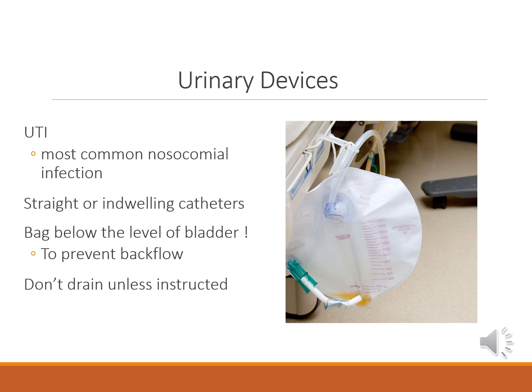A straight catheter is used for draining the bladder or inserting liquid and then removed. An indwelling catheter has a cuff on the end that holds it in place for long periods of time. While a patient with a catheter is in the department, you always want to keep the bag that collects the urine below the level of the bladder and not allow urine to drain back into the bladder. Never disconnect the drainage bag, clamp, or tubing, and do not drain the urine unless told to do so by the patient's nurse or physician.